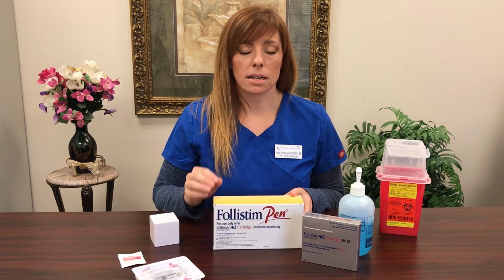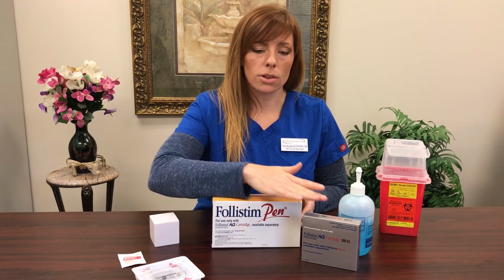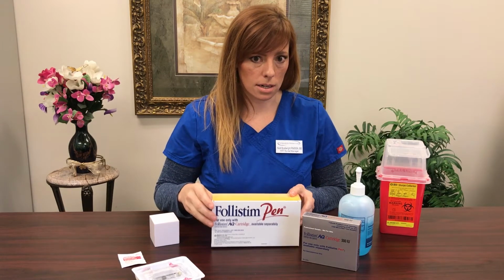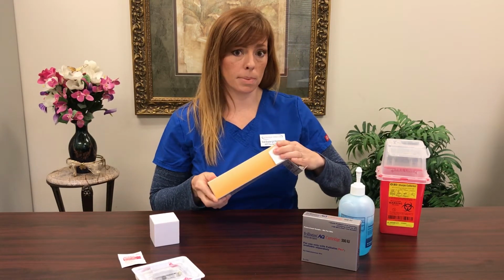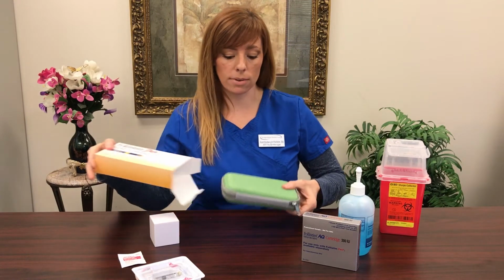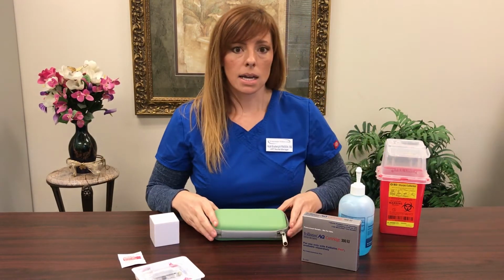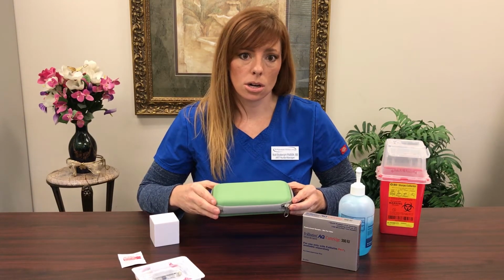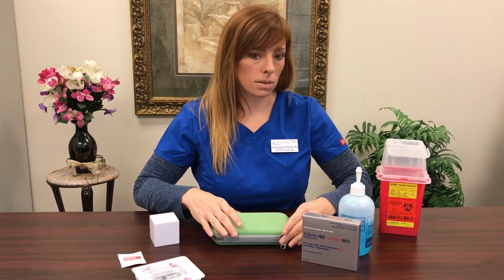So before we clean our hands, I want to open up the pen because you do need a kit along with your medication cartridge to get started. So this box, you're going to open that up. It's going to be something you'll probably carry along with you throughout your stimulation cycle. Just keep it in the same spot. If you needed to go to a friend's house for dinner or out to dinner, you'll need to take this kit with you.